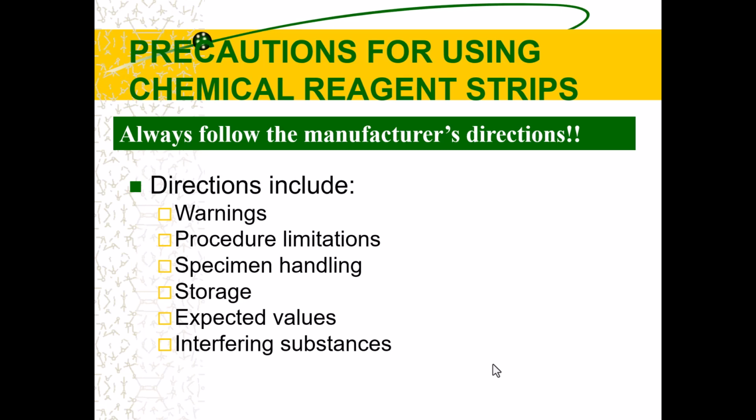What happened was these new test kits required a particular swab. In the past, they could always just use the basic cotton swab. These test kits said specifically do not use a cotton swab. They hadn't read the new insert of the new test, and they were still using the same swabs that they've been using for 15 years. When I brought it to their attention, they said, oh, it just got missed.